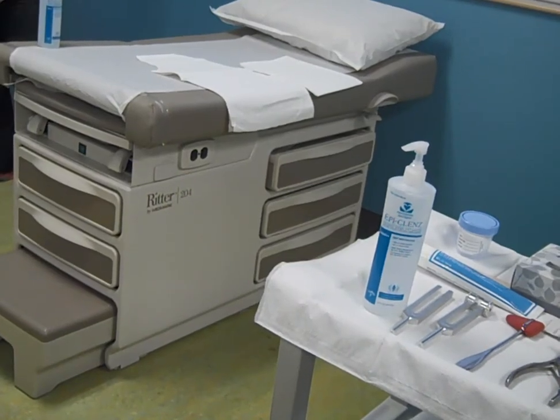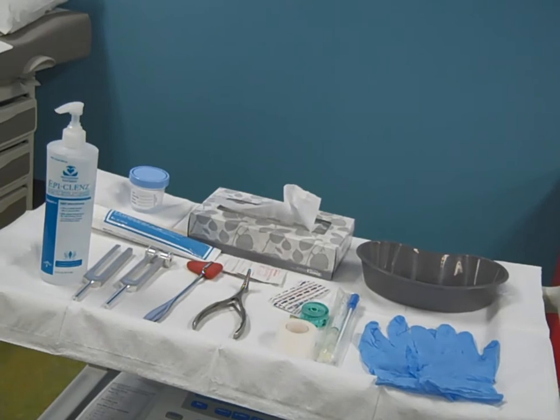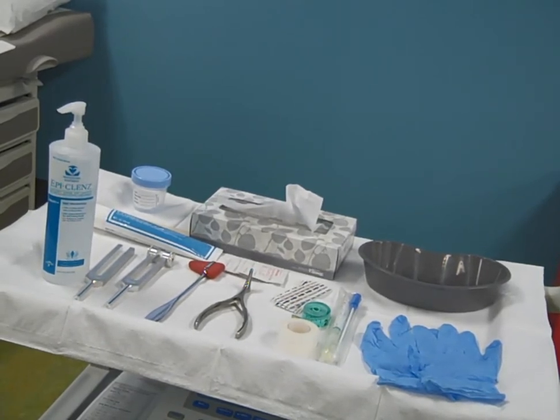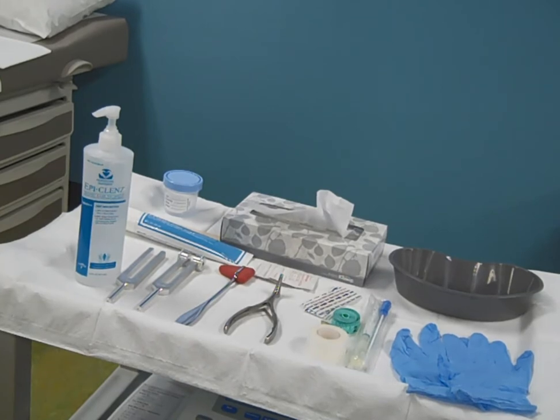This video will show you how to assist with a complete physical examination. Equipment and supplies will vary depending on the type and purpose of the examination and personal preference of the medical provider. Here you will see many different types of medical supplies that may or may not be used during a physical examination that you are assisting with.